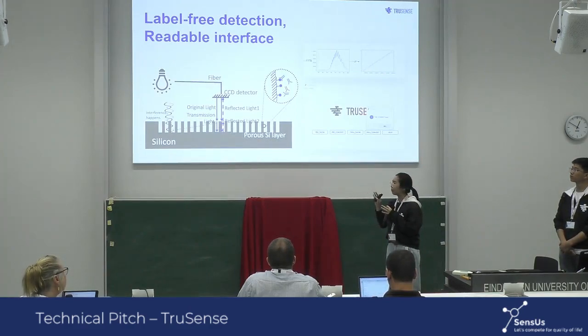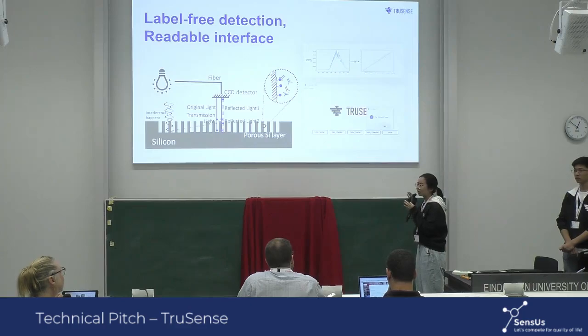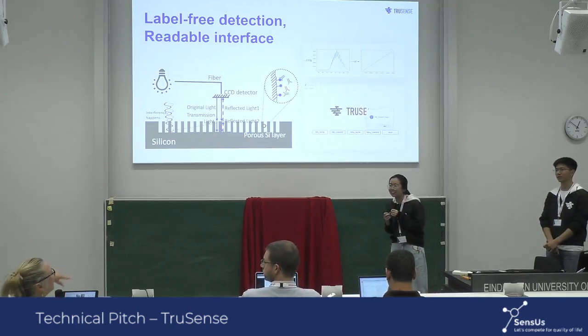What causes changes is the index of refraction. So the equation we have is effective optical thickness equals two multiplied by the index of refraction and the length of the light path. So what we do here is move the index of refraction to the left side. But you don't need to go into that much detail.